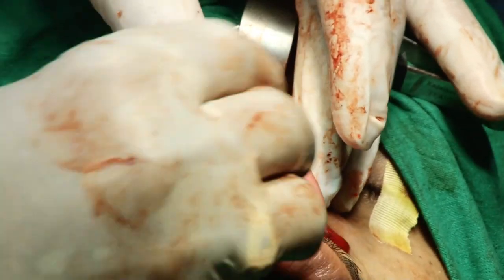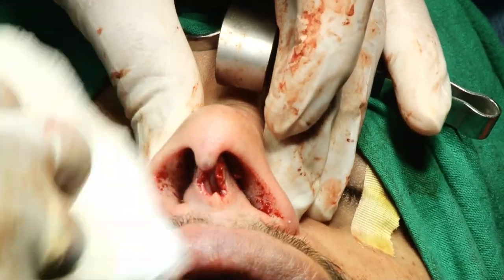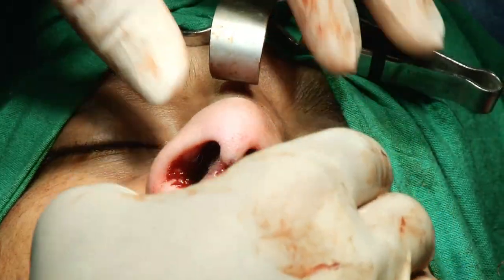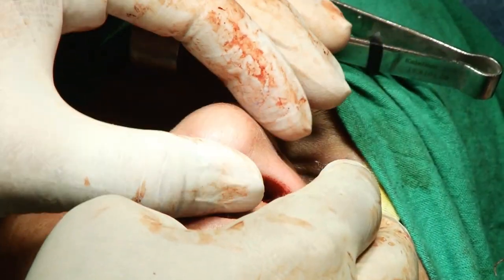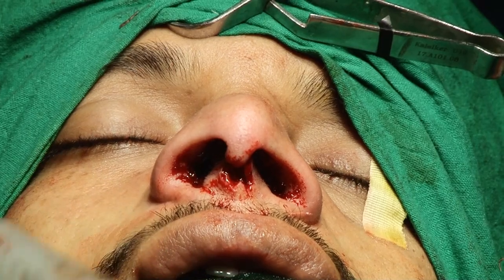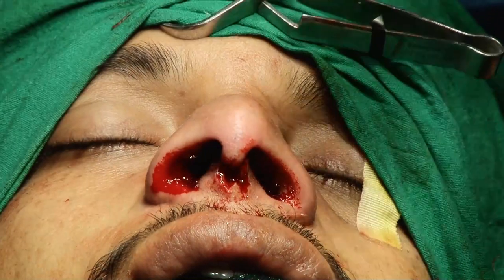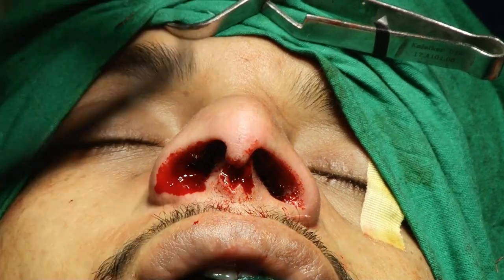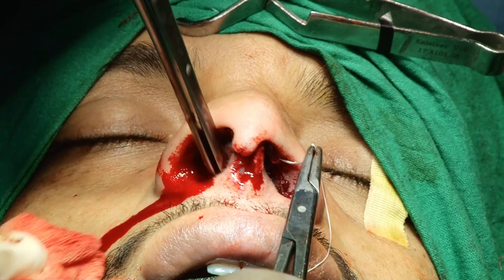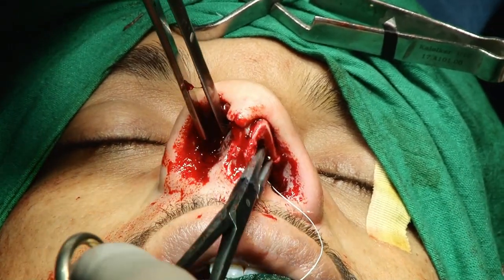Give me a suture. I first put it. I use this quilting suture just to decrease the dead space. The quilting suture is a very important suture to prevent any unnecessary hematoma formation.